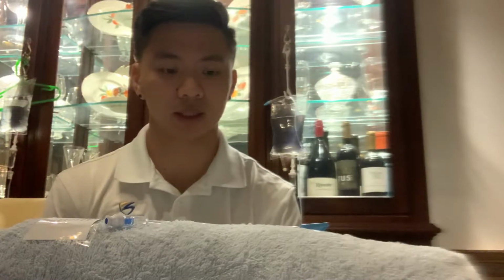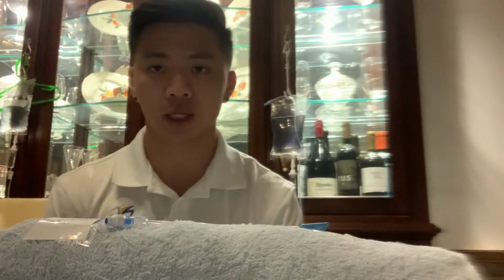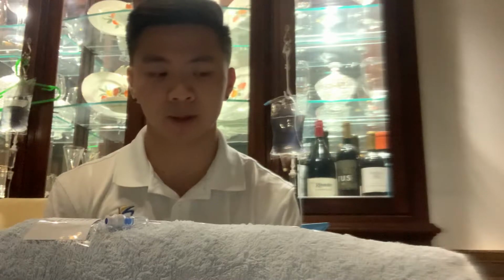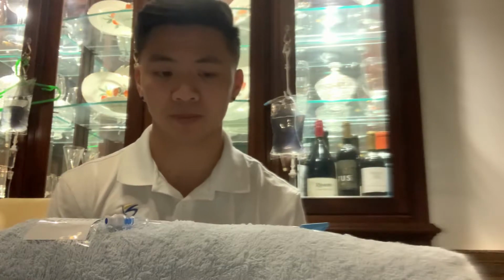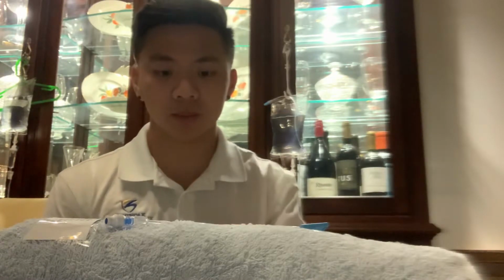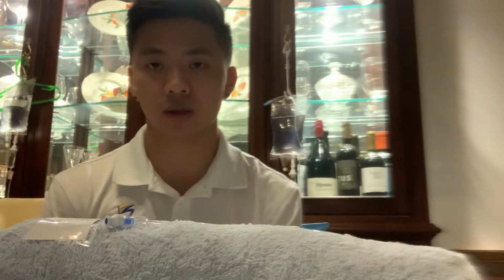I'm going to go ahead and check any allergies. So penicillin, your reaction is hives. Okay, verify that wristband, verify the computer. So today I'm going to be giving you IV infusion. It's going to be 0.9% sodium chloride, and all that is going to do is just increase your total body fluid.